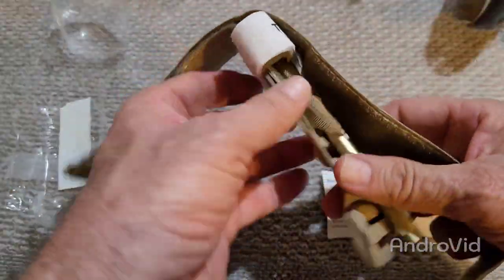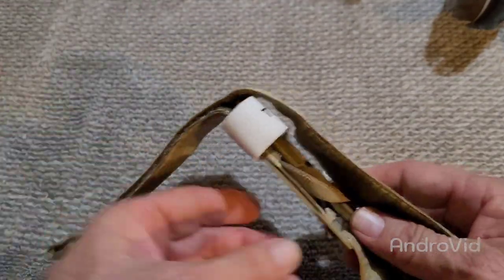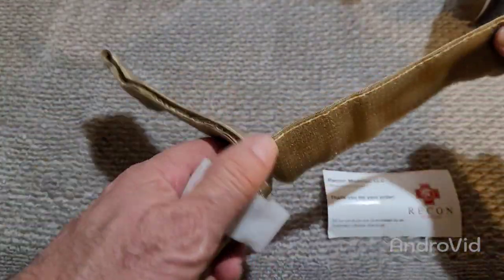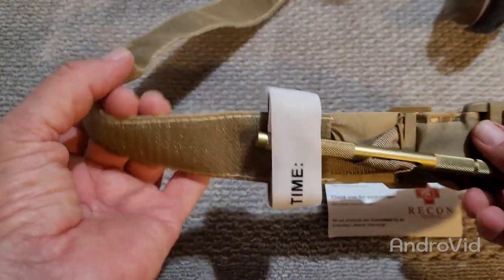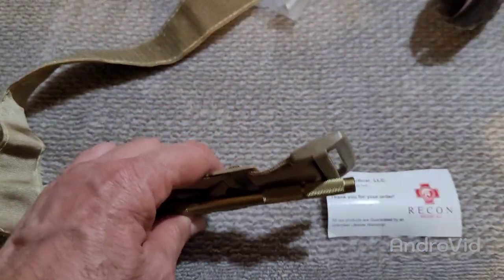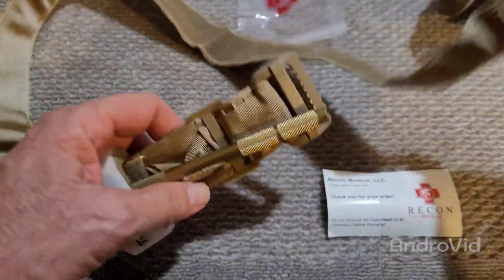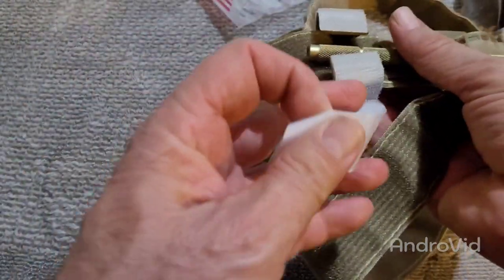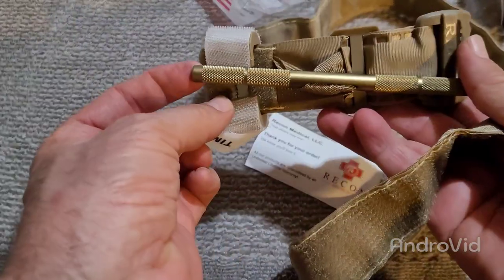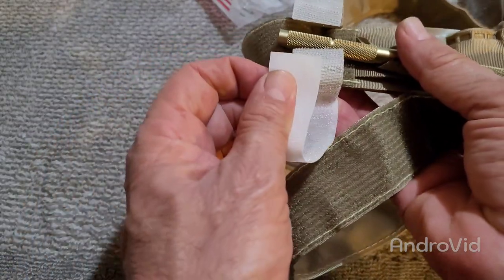Take it out of the wrapper, because you don't want to be fumbling with this when you really need to. When you're in your most critical of times, you seem to lose a lot of your fine motor skills. Let me show you how I do this. This thing is really well constructed. I really like their tourniquets.